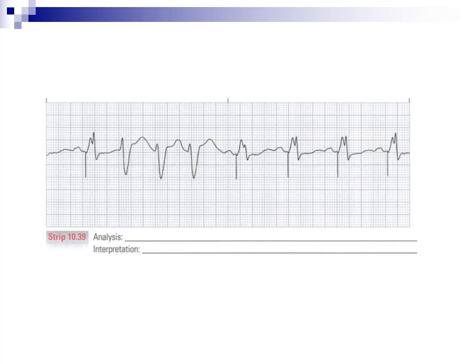This concludes the review of the homework for the AV blocks, ventricular rhythms, and pacemakers.